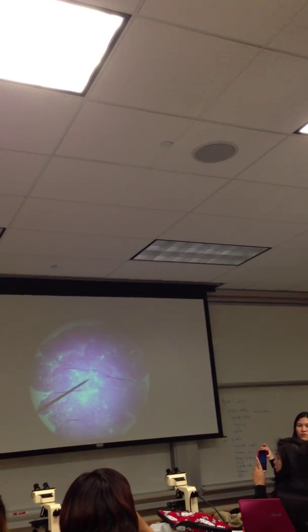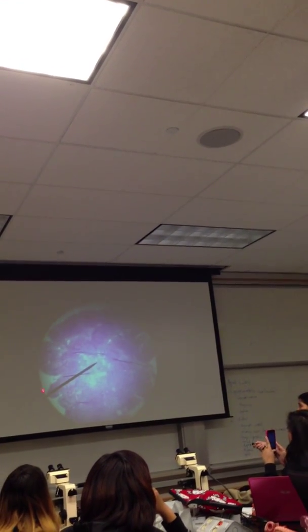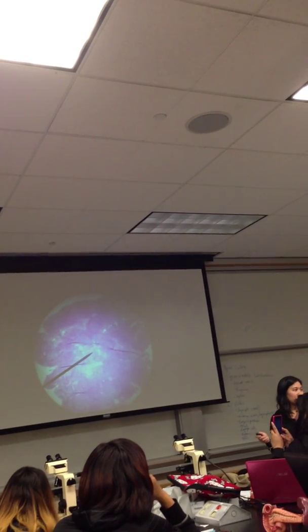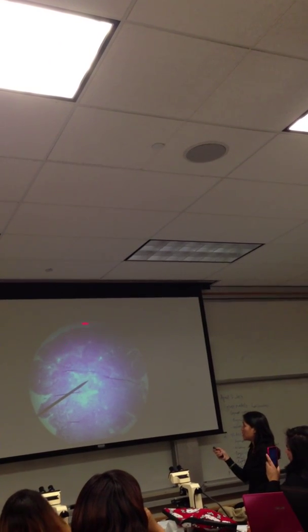How many of you say lymphoid tissue? How come you're not sure? I say it's an organ. It's not for sure. Okay, do you see any capsules around it? It's like a mass of tissues, right? I mean, it's a mass of just kind of like the Peyer's patches that we saw earlier, okay?